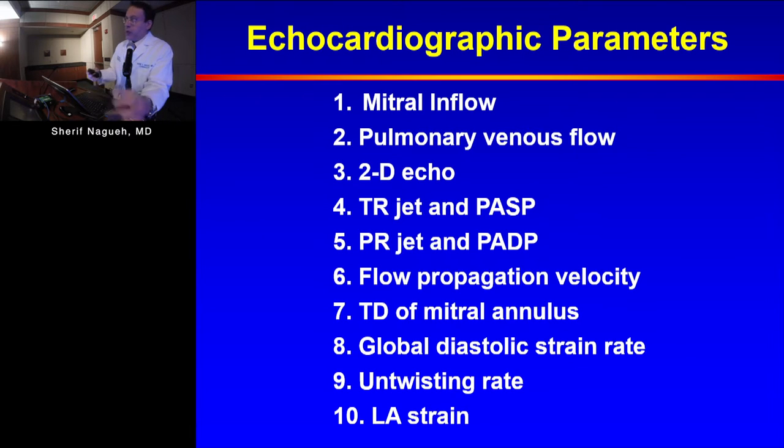So now, what do we want to get out of an echocardiographic examination? We want to come up with statements about, is relaxation normal? Is it abnormal? The word diastolic function or dysfunction is a broad term. When we speak about diastolic function, we should speak about relaxation. Is it normal or abnormal? Stiffness, is it normal or elevated? Virtually all hearts with myocardial disease have both elements present, impaired relaxation as well as increased stiffness. So we have several signals, and these several signals have a lot of variables that determine them. The challenge is to use the variables that we have to draw conclusions about diastolic function.